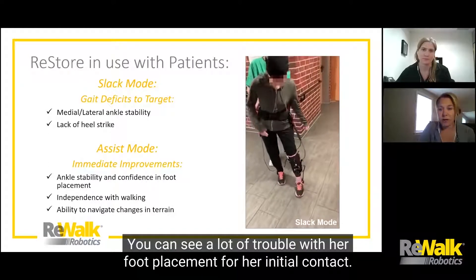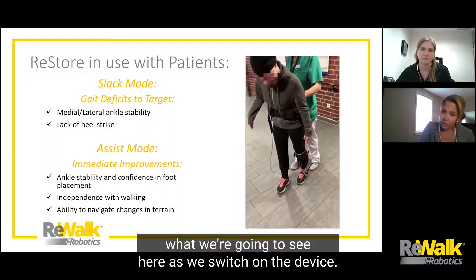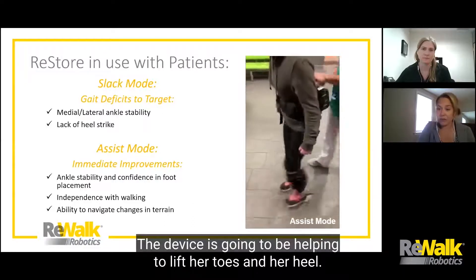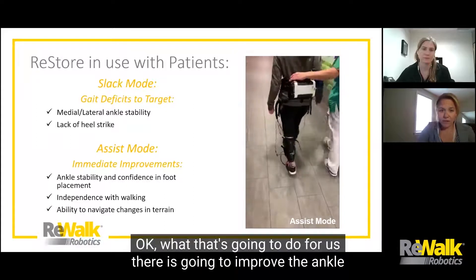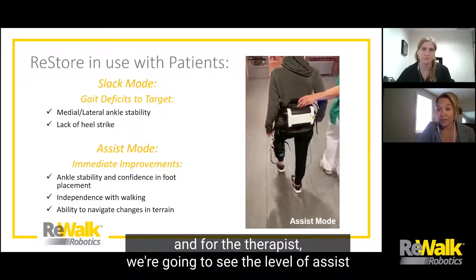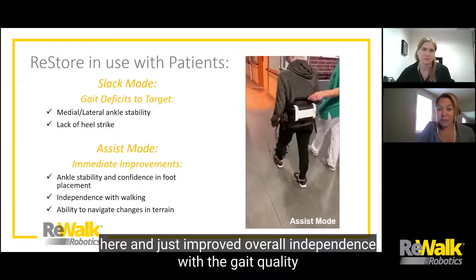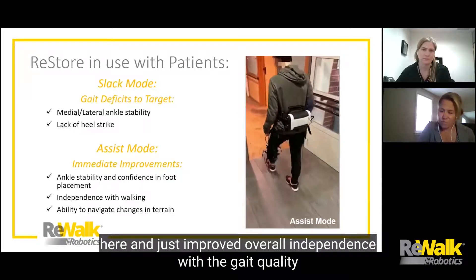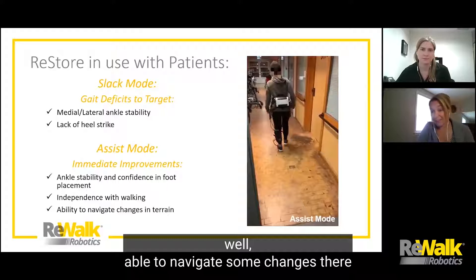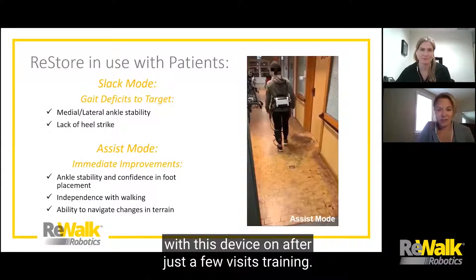You can see a lot of trouble with her foot placement for initial contact — there's really no heel strike happening, and a lot of medial-lateral instability. Now we switch on the device into assist mode, where it helps lift her toes and heel. That improves ankle stability and confidence for foot placement — for both the patient and the therapist. The level of assist needed minimizes significantly, overall independence with gait quality improves, and her walking speed definitely increases. She's also able to navigate terrain changes, like going through a doorway, after just a few training visits.